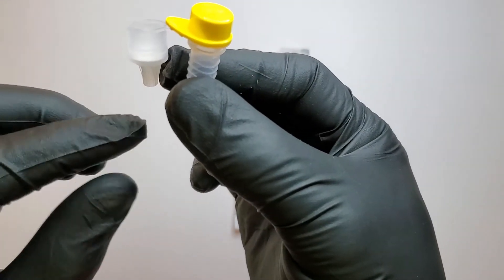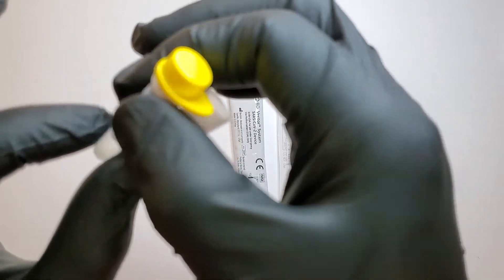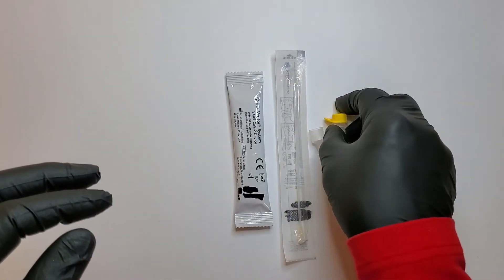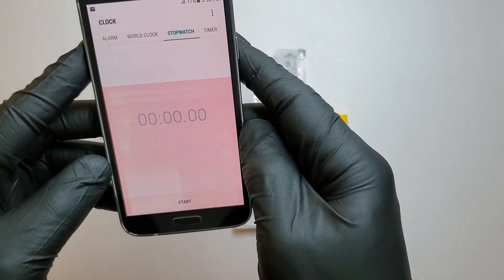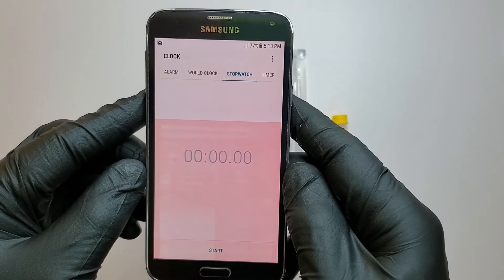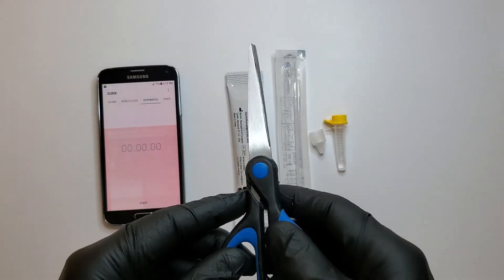This adds the liquid to test the swab, to get the sample from the swab. My personal touch is my cell phone — I'm going to use it as a timer — and a scissor.